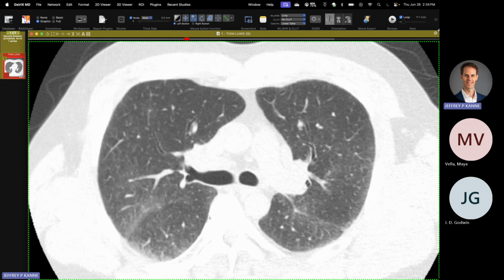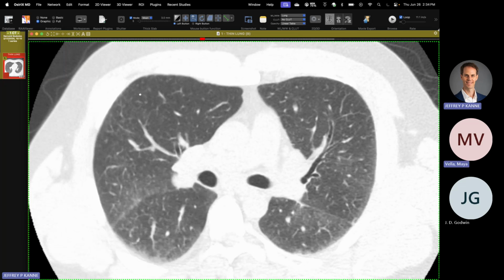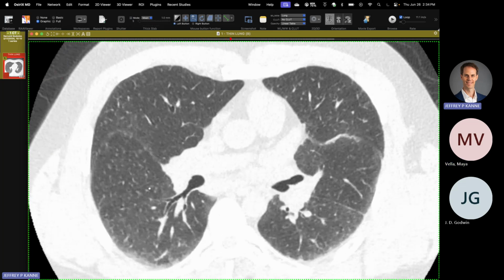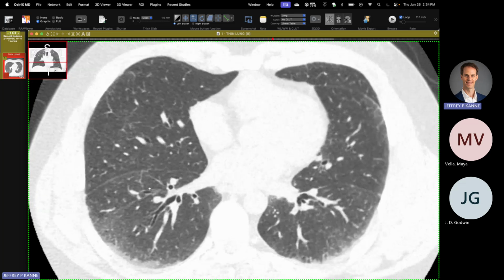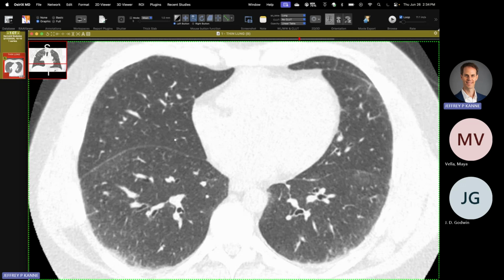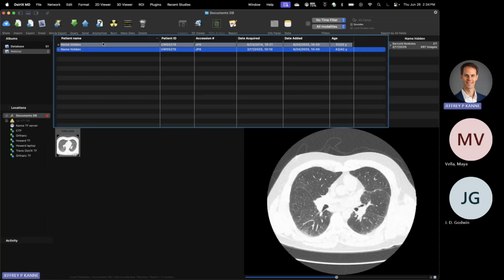And it's hard to pick up the perilymphatic distribution, but really what you can see is along the fissure, they're clustering out there, and then the lymph nodes kind of give you a little bit of a boost in confidence in that. And it's not HP because, of course, HP nodules should be fairly exquisitely centrilobular, and they're usually more extensive than this. They don't have quite the sparing that you see in the base down here. So a case of sarcoidosis with tiny, tiny ground glass nodules that look a lot like ground glass opacity. So that is all I have.